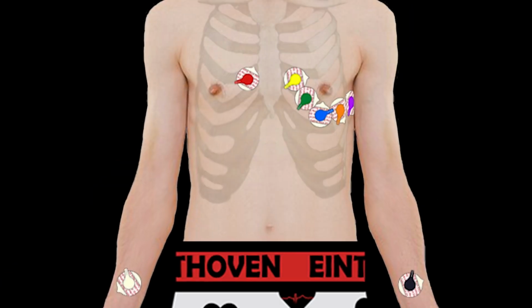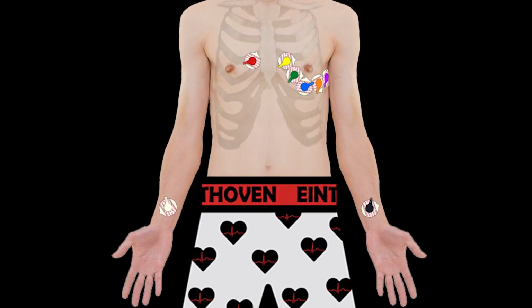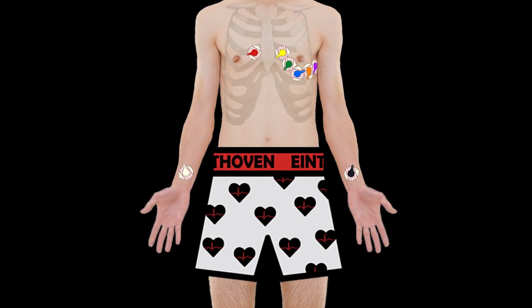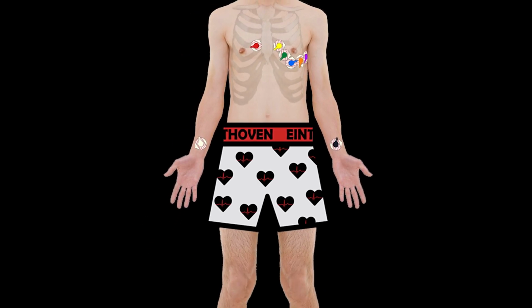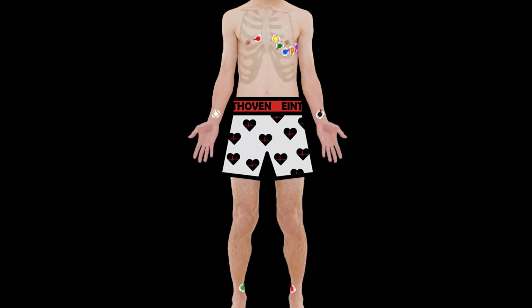Because the angle is so important, in a 12-lead EKG, we place electrodes all around the heart. Each electrode has a slightly different angle to the heart and will create a different EKG tracing based on its own point of view. To understand how that works, we need to talk about something called a lead. A lead is an electrode or set of electrodes that's used to make an EKG graph. Let's look at some examples.